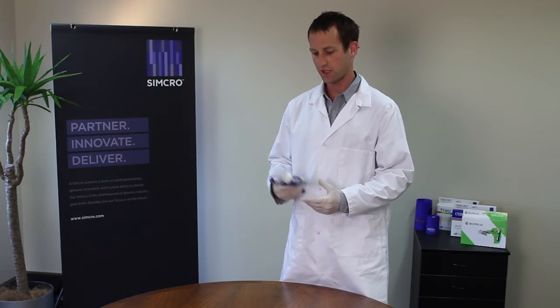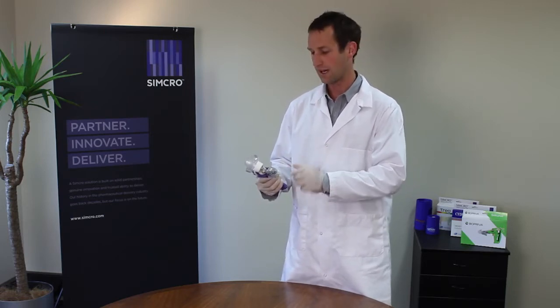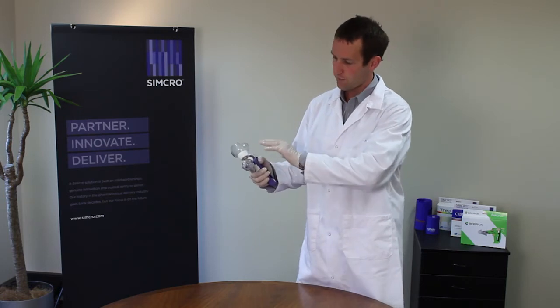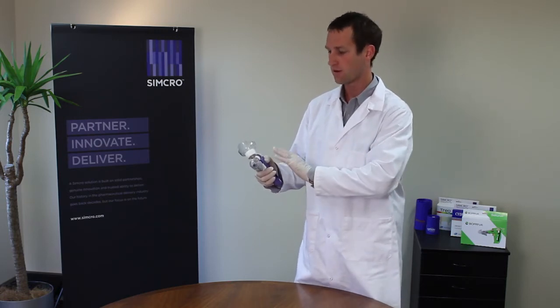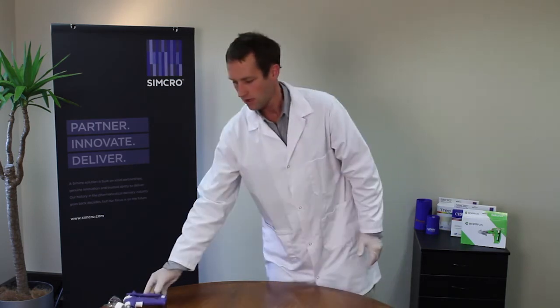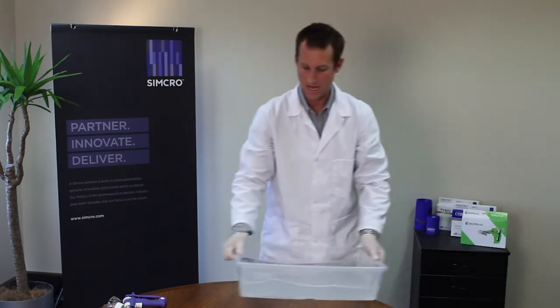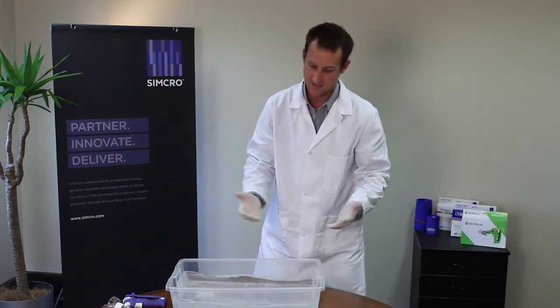Finally in this video I'm going to show you really simply how to clean this injector — really, really easy. Obviously we've removed the bottle and the needle and dispelled the product from the barrel, so there's no product in there. Simply grab some soaking water — this can be done in a bucket, a clean bucket.